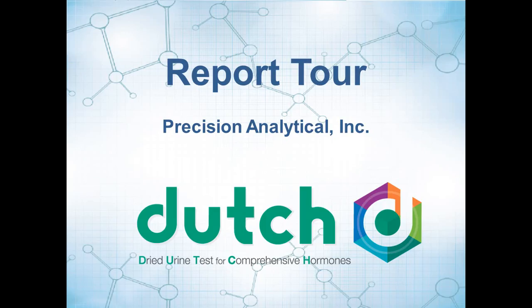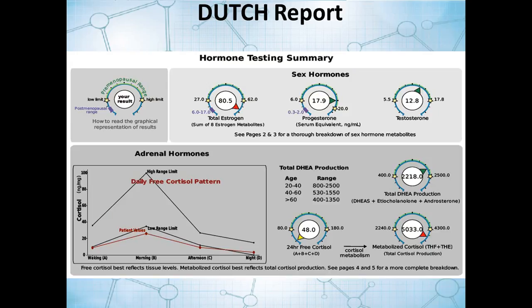This is a report tutorial from Precision Analytical. We have other videos that go into more specific areas of the report, but just as a general overview of the report, what you're going to find on page 1 is an overview of your hormones.